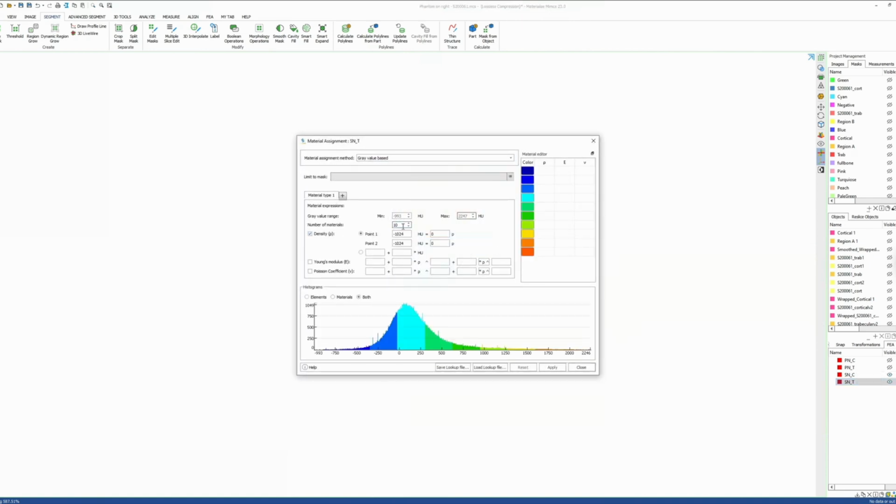Once you've identified your Hounsfield threshold units, we're going to create a gray value based material with a 20 number of materials. Here you can see that I'm identifying the -24 Hounsfield unit as a density of 1 gram per centimeter cubed. Thanks to my thresholding line, I've identified a Hounsfield unit of 1426 as my density of 1.82 grams per centimeter cubed. Here you can see me using the Morgan et al. relationship for Young's modulus to density and applying a static Poisson coefficient of 0.3.